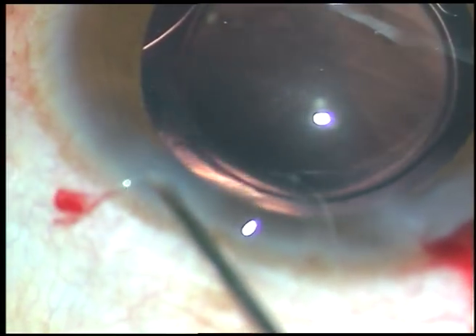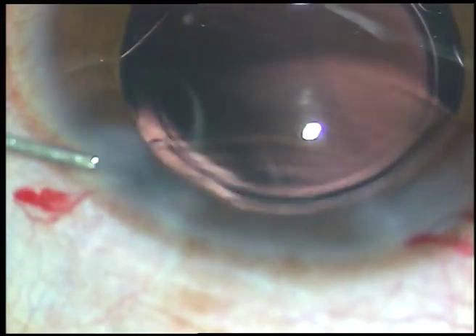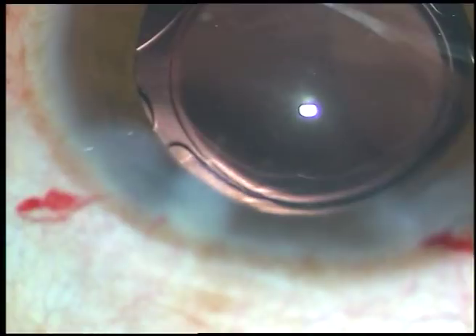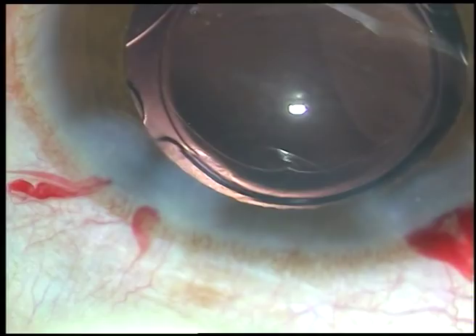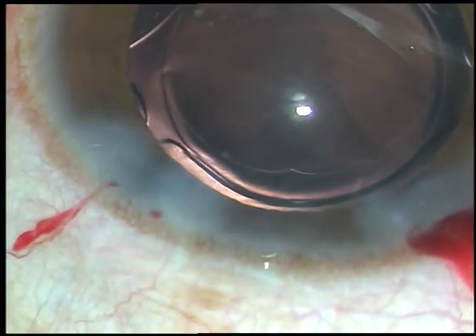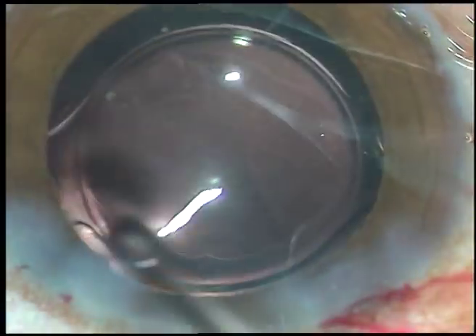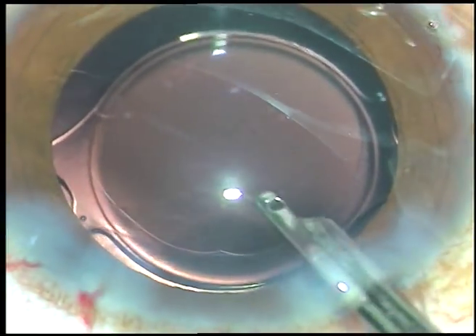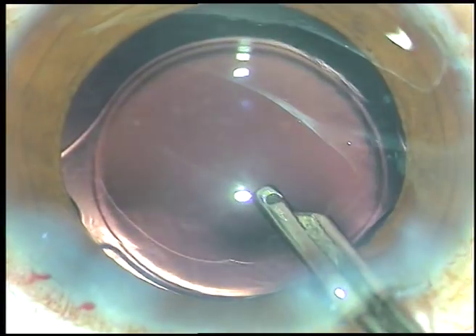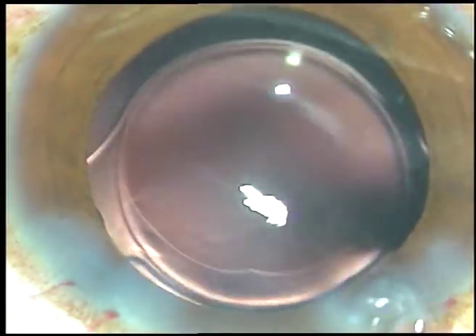Now the stroma of the side port is hydrated. The stroma on either side of the stab incision is hydrated and the stab incision closes, becoming watertight. This is the final lavage — whatever visco sticks to the corneal endothelium will come out. You can see that the visco sticking to the corneal endothelium came out. I was at a respectable distance away from the corneal endothelium.